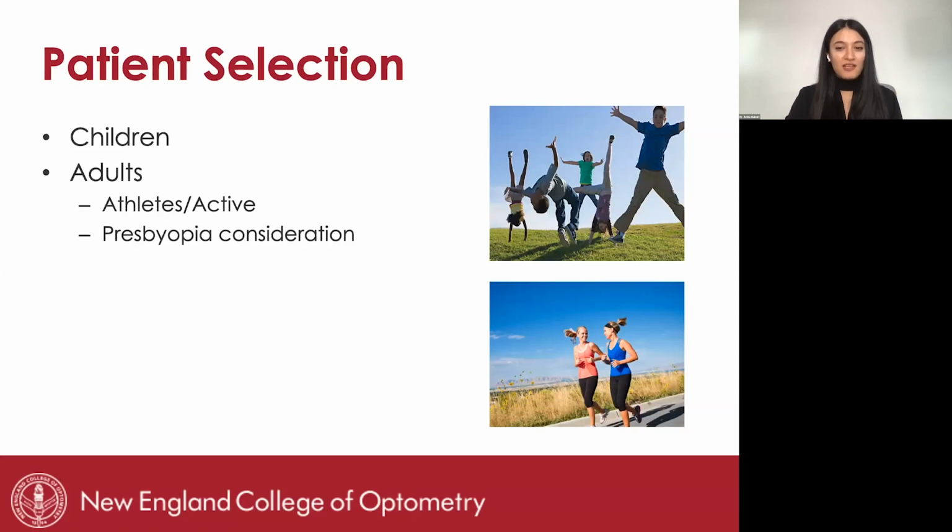So when we're educating these presbyopes regarding their visual expectation, it's really important to mention that that slight hyperopic refraction in the morning may kind of hinder their near vision. So they can wear low plus reading glasses in the morning, or their target can be cut back a little bit, so we can make the target less hyperopic. So in the morning, they're still able to read. But then this kind of has the drawback that the distance vision will be slightly blurrier at nighttime.